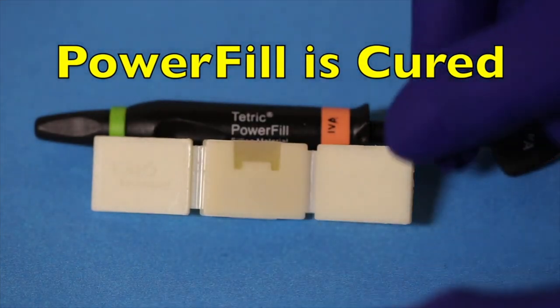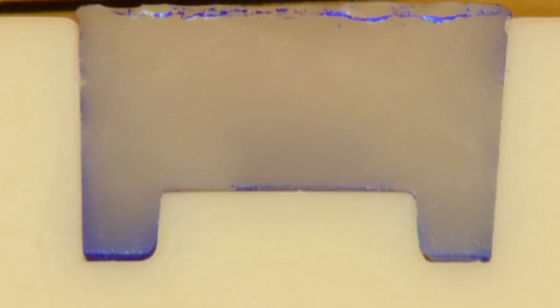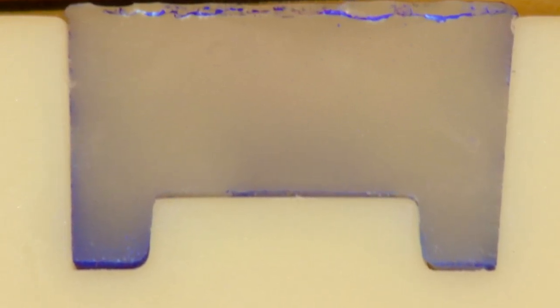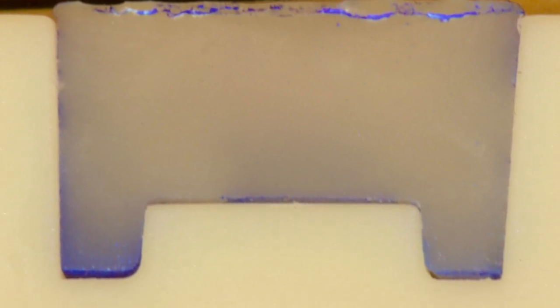Despite the shorter curing time and the fact that we placed this in one increment, you can see that the material is cured even at the bottom of the proximal boxes. Here we can see a close-up and there are no knit lines in this restoration.